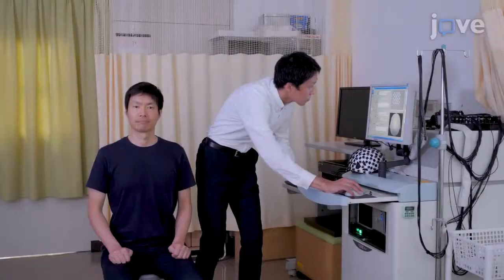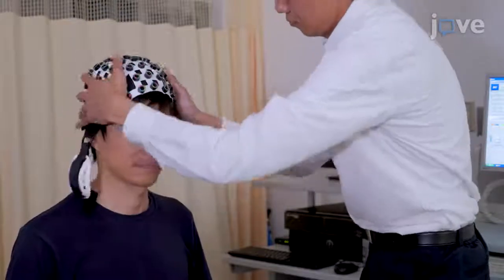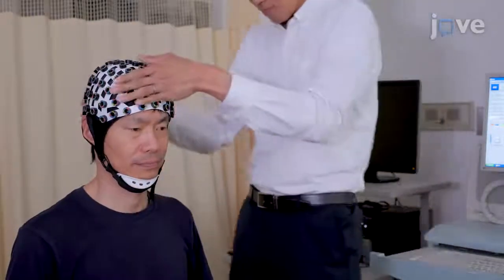Before performing an fNIRS experiment, place the fNIRS device in a dark, noiseless area and place a whole head fNIRS recording cap onto the head of the subject such that the position corresponding to the center of the International 10 to 20 system is located at the number 245 holder of the head cap.